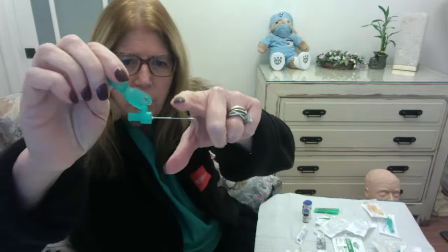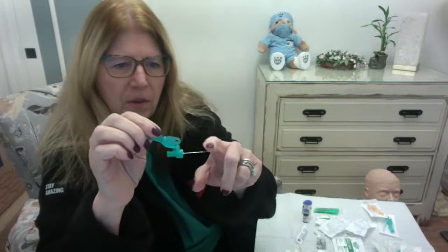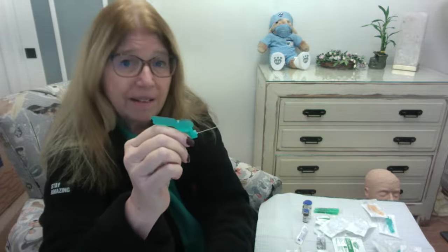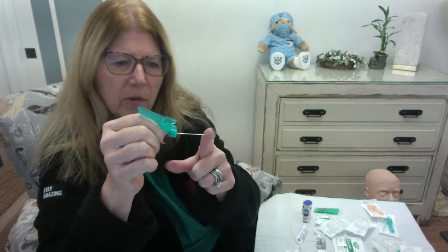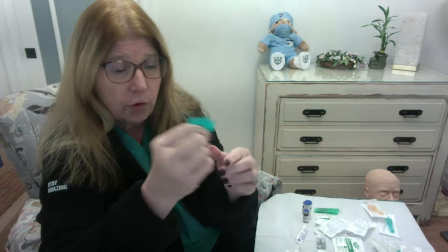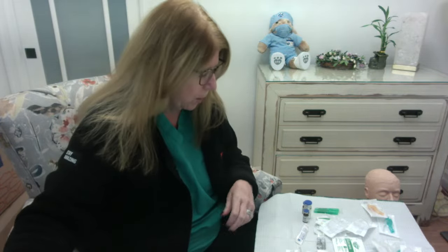And this is referred to as the bevel of the needle. So the bevel of the needle, when you're giving an injection at less than 90 degrees, you always want the bevel facing you so that the pointiest part of the needle goes into the patient's skin first, to make it less of a painful injection, okay?